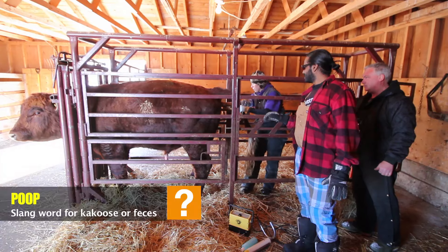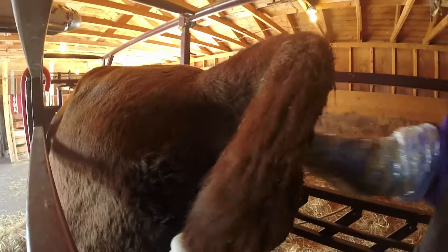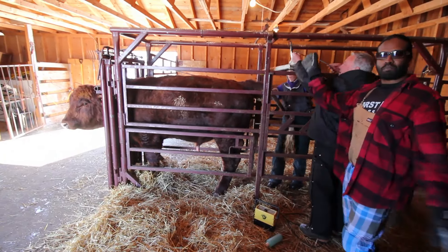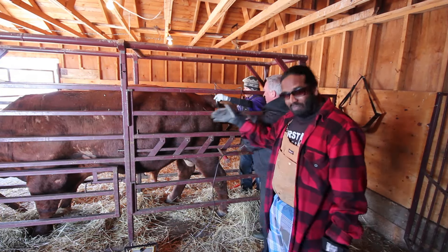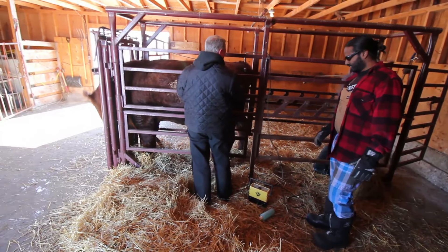At the same time we take the poop out and stimulate them a little bit. The goal of today is to have the bull ejaculate so you can test the sperm. This right here is the probe. It provides electrical stimulation — we control the intensity and the time with the ejaculator box.